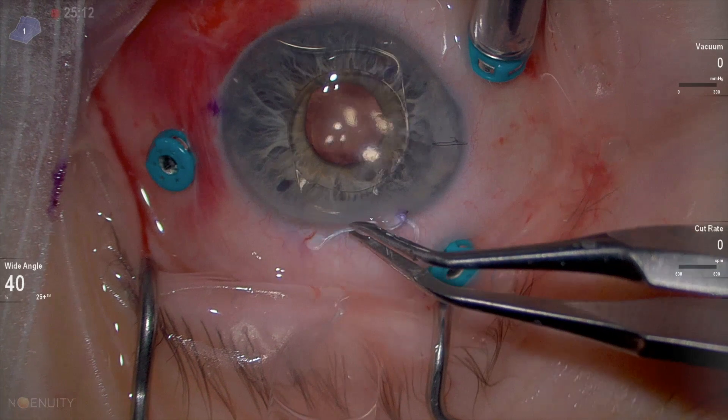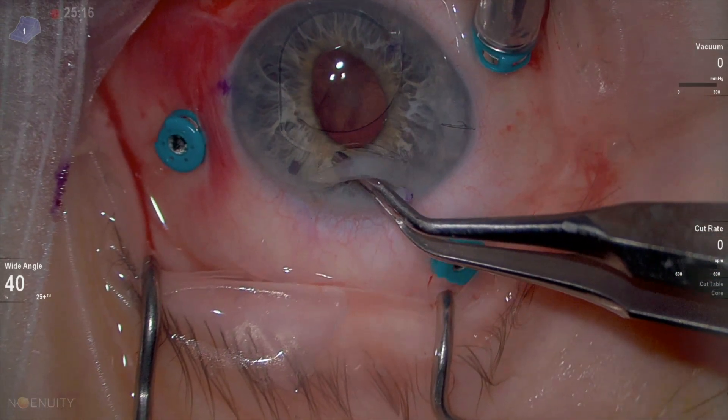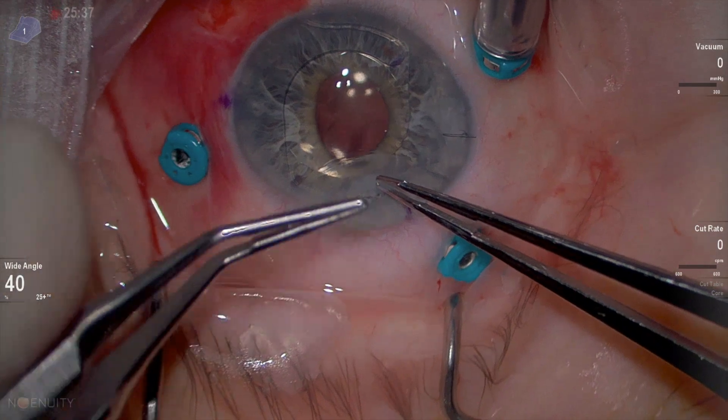Now putting the trailing haptic — it needs to be tucked under the wound. Go in and tuck it under the wound. This is very important: make sure that it's really inside the eye and not in the wound.